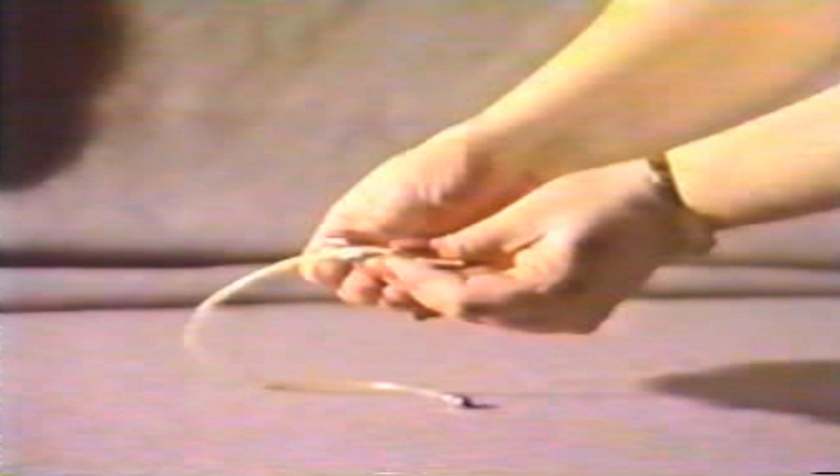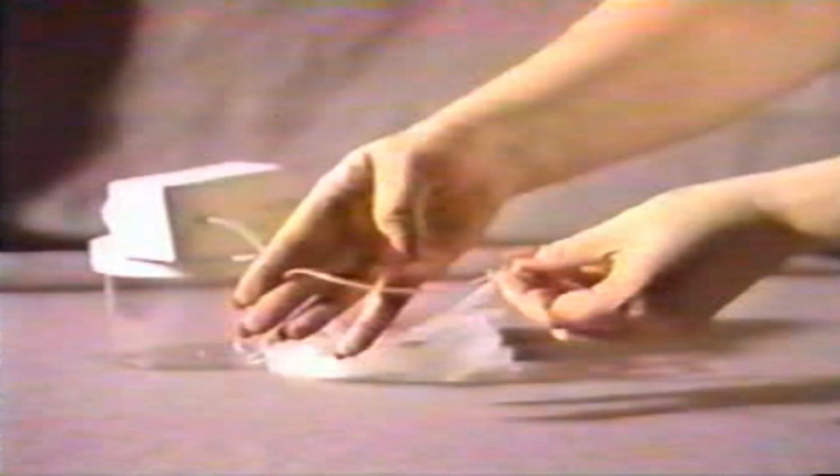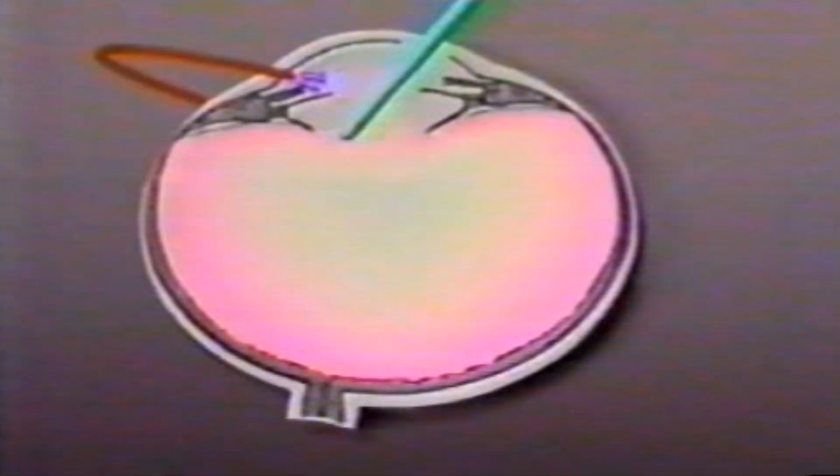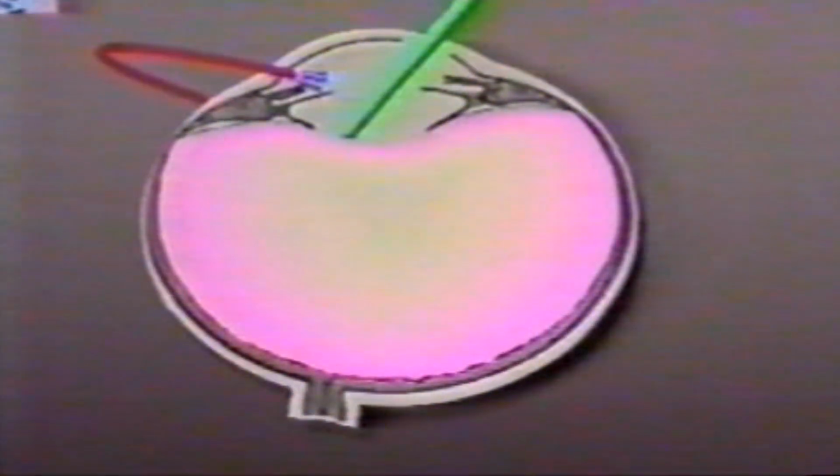In the presence of a posterior capsule tear, the tear gets tamponated by the anterior chamber maintainer, and there is no hydration or very minimal hydration of the vitreous, thus allowing us to do the anterior vitrectomy or remove the vitreous from the pupillary area and the anterior chamber very effectively.